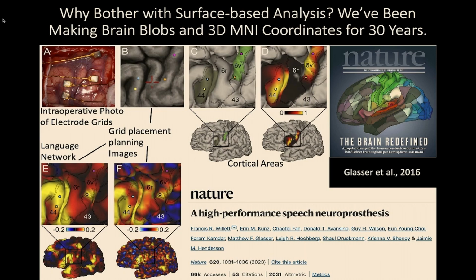What was done in this particular study was to map the HCP's multimodal parcellation onto this particular patient's brain. To do that, first we acquired MRI scans along the lines of what I'm going to talk about in a moment, what we call an HCP-style MRI acquisition with high spatial and temporal resolution fMRI and T1 and T2 weighted imaging. And so we've gotten the group average areas onto this individual's folding pattern.